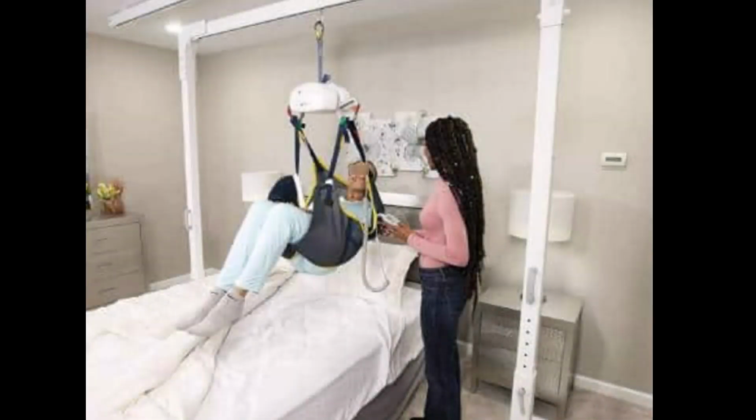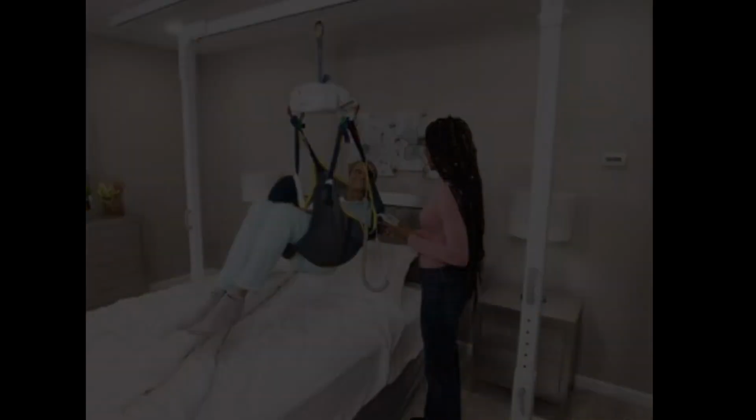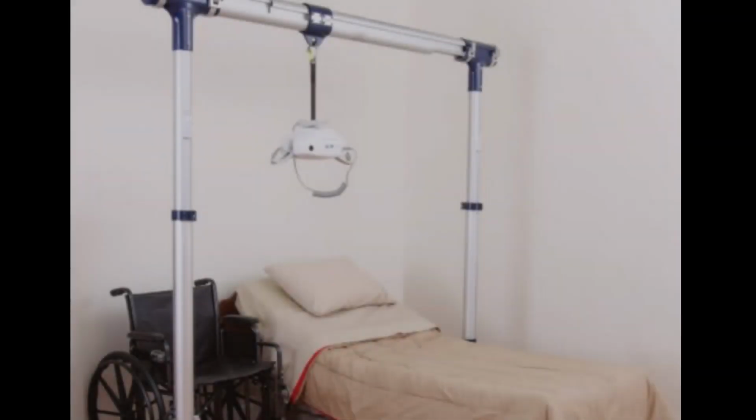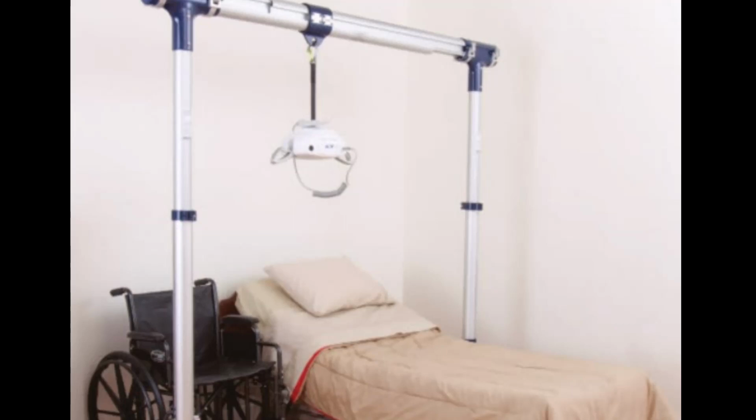Portable lift systems. Now is a good time to introduce the portable overhead lift systems that are not commonly found at facilities but more so in the community. We have portable systems that can be temporarily set up in facilities or clients' homes.